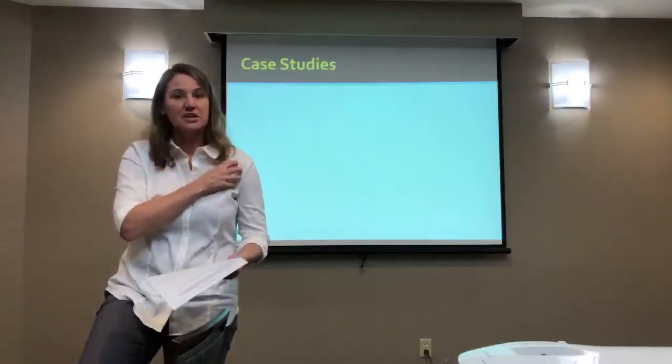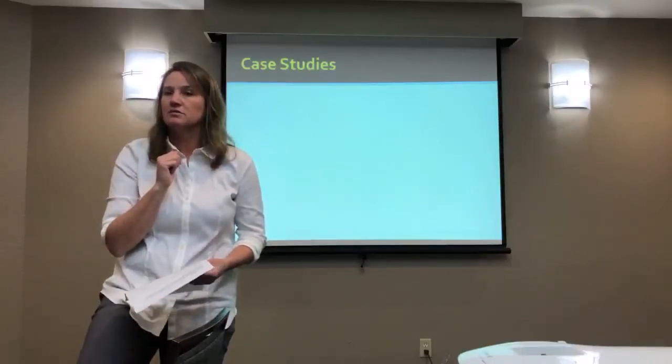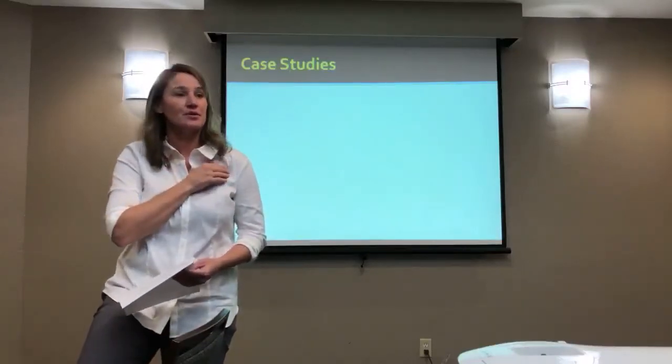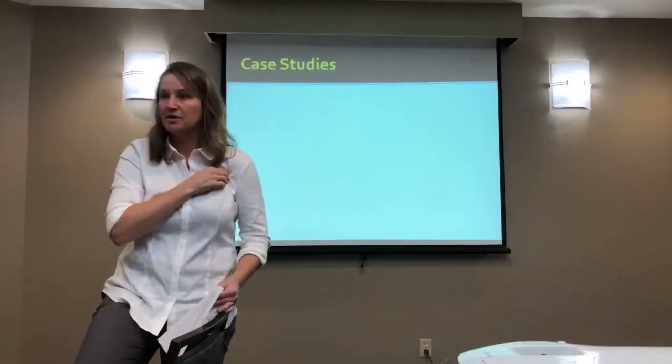Okay, so you identify your structure and you're going to do thermal levels of ultrasound. So what frequency would you use? Depends on the structure, exactly. Depends on the structure and the person. If we're saying pec minor, at least one. Definitely if it's pec minor, one.